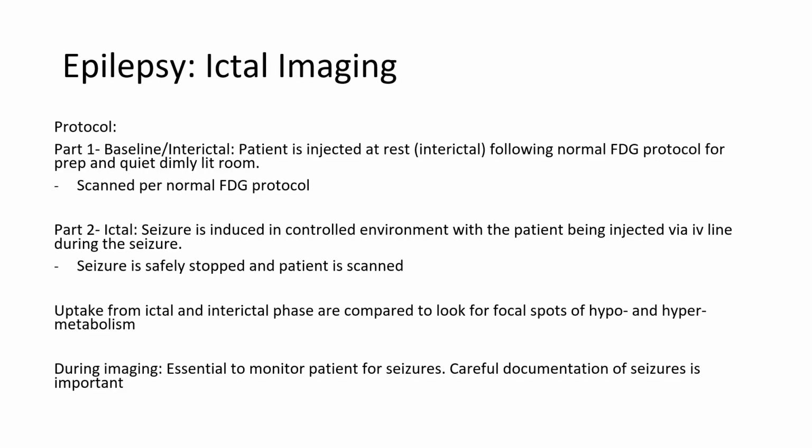So the goal there is to inject them while they're seizing, and then they can calm down after that. After they are injected, the focus should be on making sure the patient is safe, but also that they are in a quiet, dimly lit room and that they're not talking or anything like that.